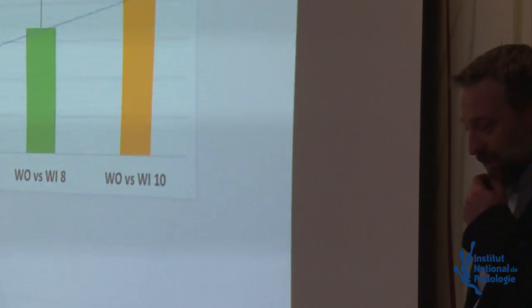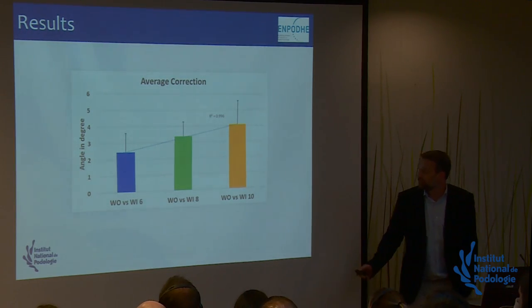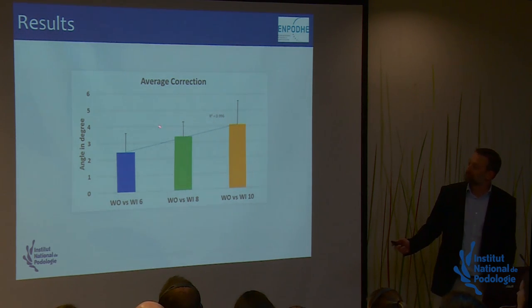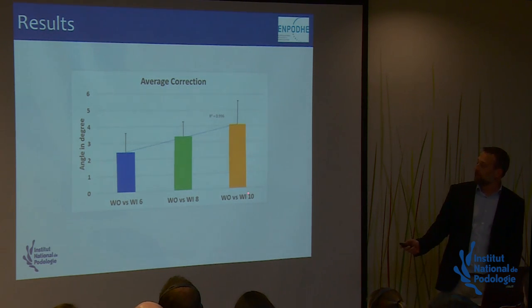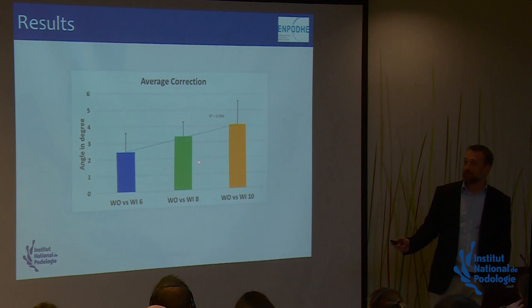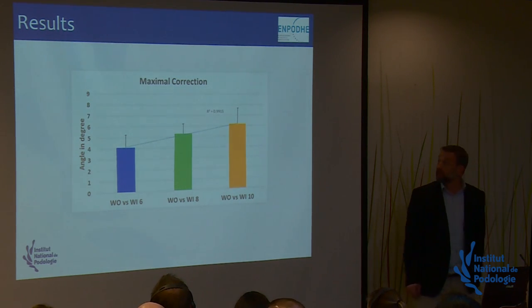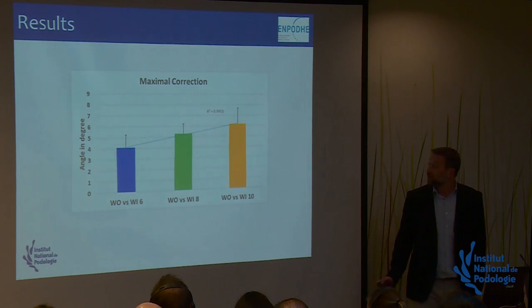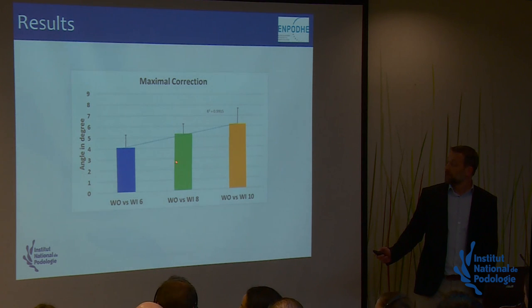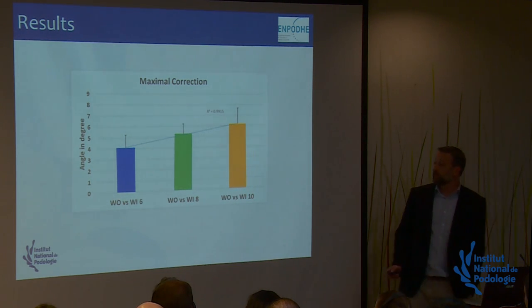Then what is the average correction? With 6 millimeters versus without, we got 2.5 degrees average correction. With 8 millimeters, we got about 3.30 average correction. And with 10 millimeters, we got a little bit more than 4 degrees average correction. And there is also a linearity between all the corrections. And what about the maximal correction? Well, 6 millimeters versus without orthosis, we got 4 degrees maximal correction, 5 degrees with 8 millimeters, and about 6 degrees with 10 millimeters.